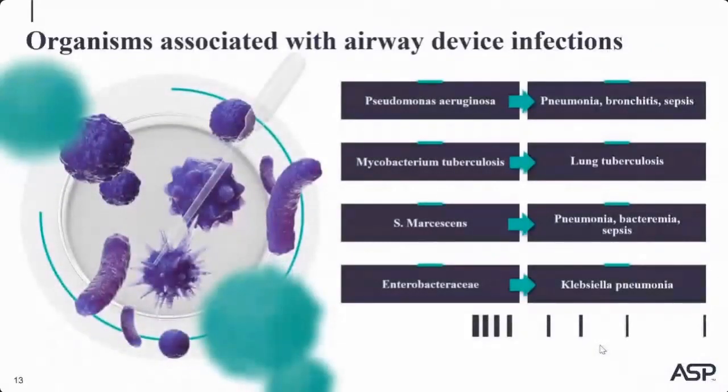The two most common organisms that cause infection related to bronchoscopes are Pseudomonas aeruginosa and Mycobacterium tuberculosis. Pseudomonas aeruginosa can be from either an endogenous source, meaning within the patient themselves, or exogenous, meaning from an outside source. An example of an endogenous infection is Pseudomonas aeruginosa resulting from aspiration of secretions in a sedated patient during a flexible bronchoscope. An example of an exogenous preventable infection during bronchoscopy is Pseudomonas and Mycobacterium being transmitted from one patient to another by a contaminated endoscope or accessories. Pseudomonas aeruginosa can have very serious complications, including septicemia and death. This is true for another opportunistic organism, Serratia marcescens.